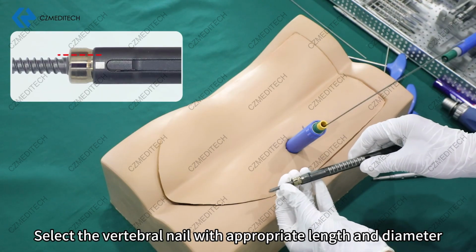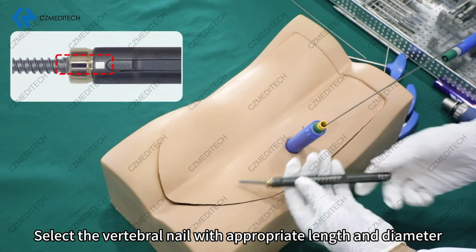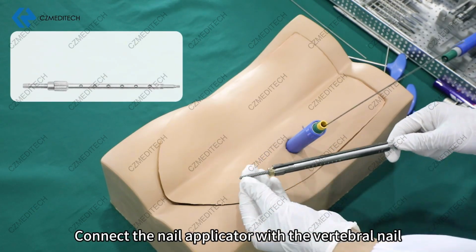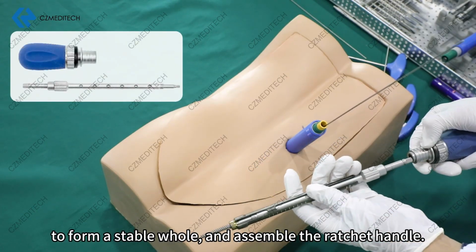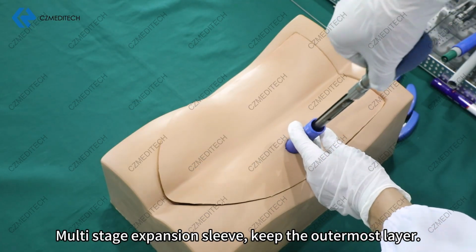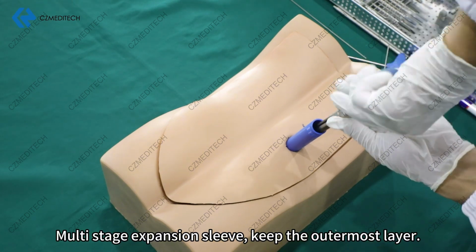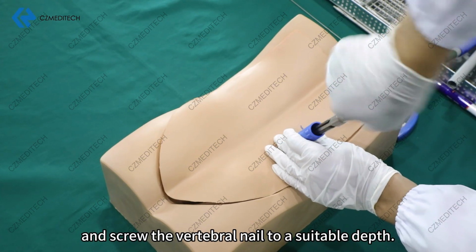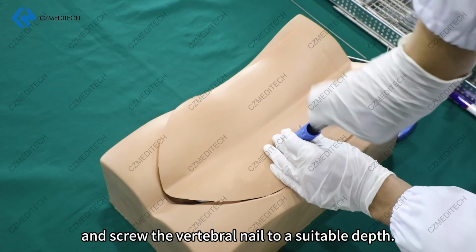Select the vertebral nail with appropriate length and diameter, and assemble the extension sleeve. Connect the nail applicator with the vertebral nail to form a stable whole, and assemble the ratchet handle. Multi-stage expansion sleeve. Keep the outermost layer. Insert the vertebral nail assembly along the guide pin and screw the vertebral nail to a suitable depth.